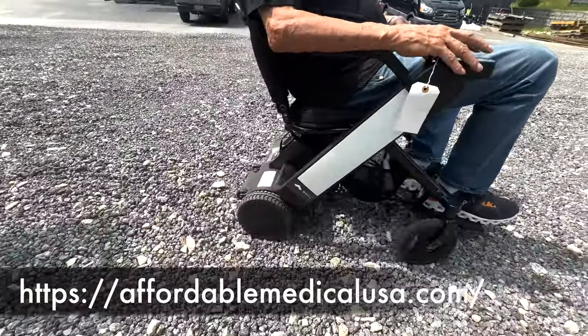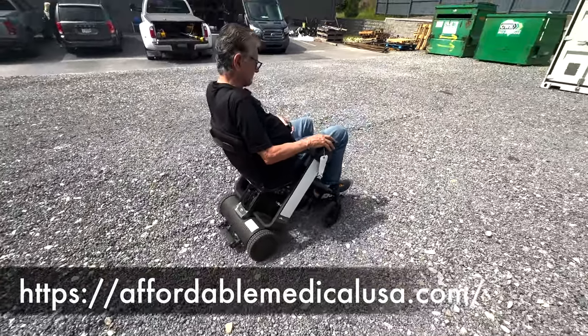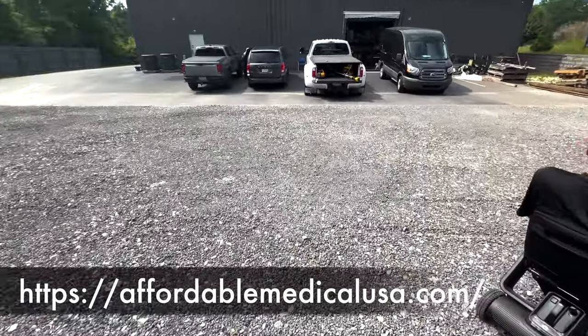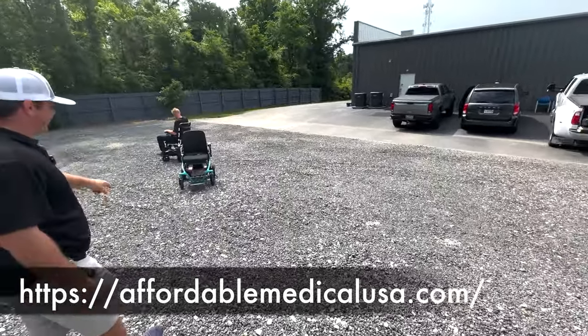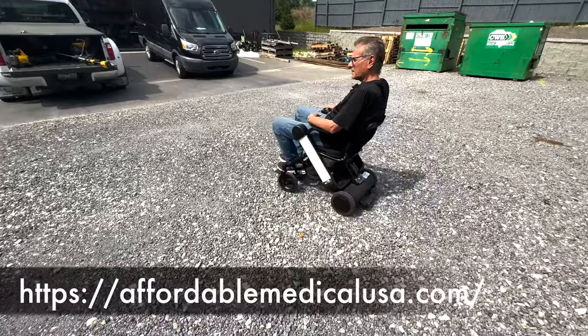If you keep turning it, it's going to make it harder. Those little wheels at the front are thin. On both the carbon and the FI, they're a little bit thicker, so this one probably does a little bit better through here.